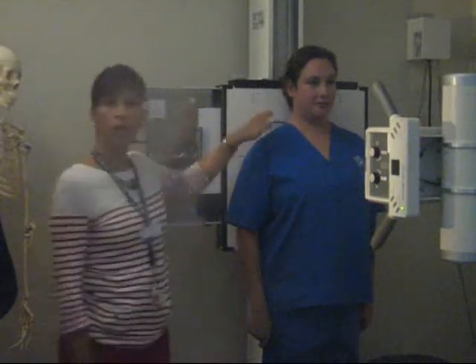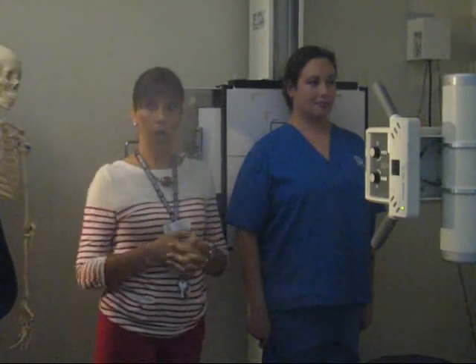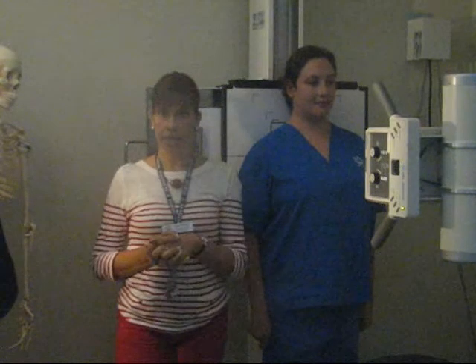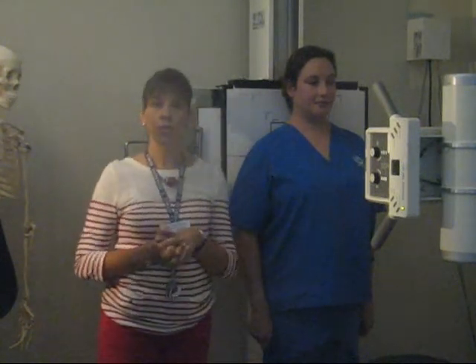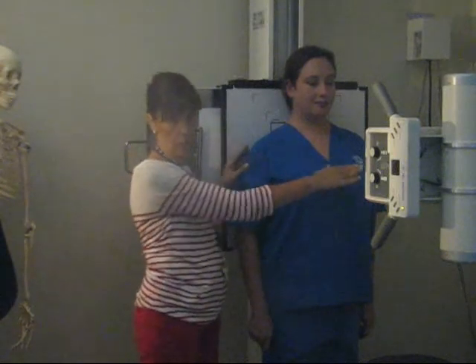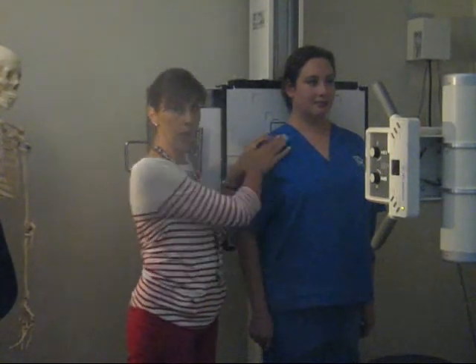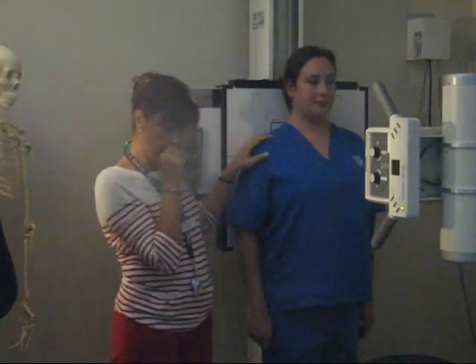Okay, we're moving on to the clavicle. There are several considerations to have when you are doing a clavicle study. In a lot of cases, if not most cases, the doctor is going to want a comparison view. Okay, so a lot of the times, if you do one clavicle on one side, you'll have to do another clavicle on the other side.